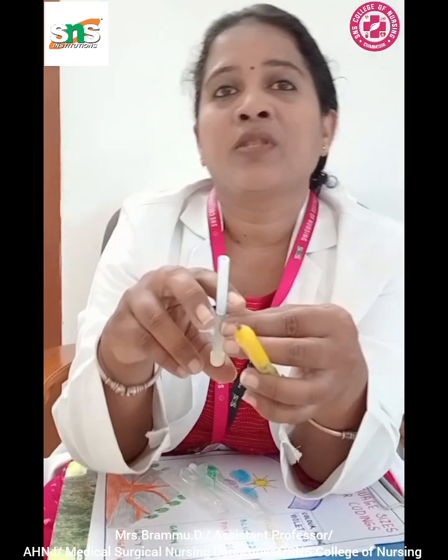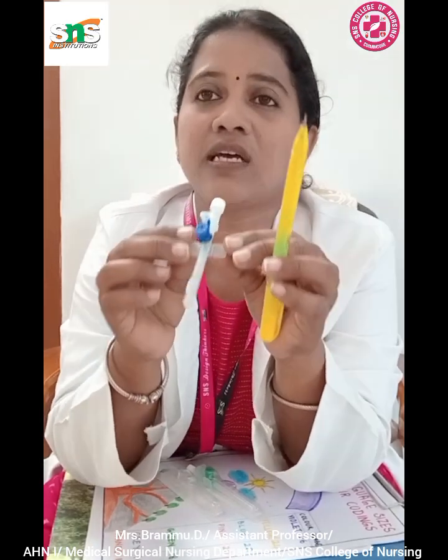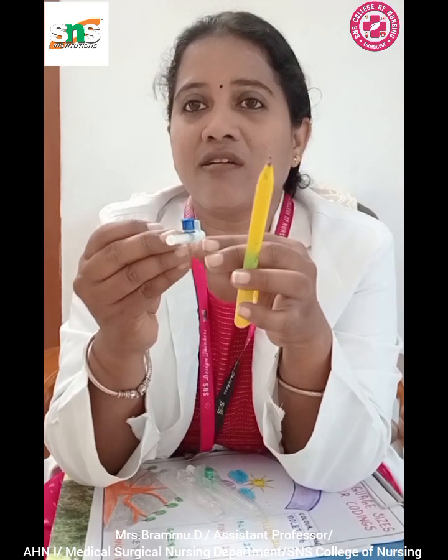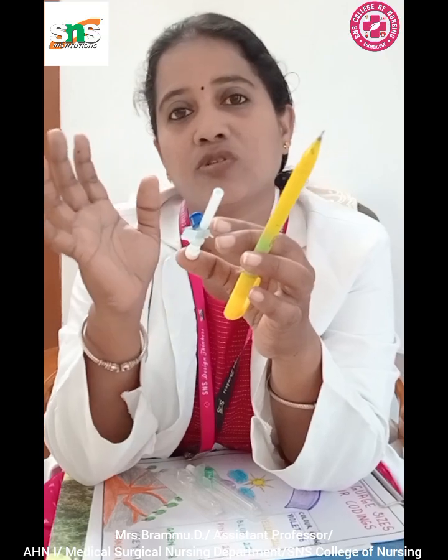So the IV cannula is handled like this, right? Extending from the hub, the wing serves as an anchor, and it provides stability during the insertion of the IV cannula, securing the cannula in place after it has successfully entered the patient's vein.